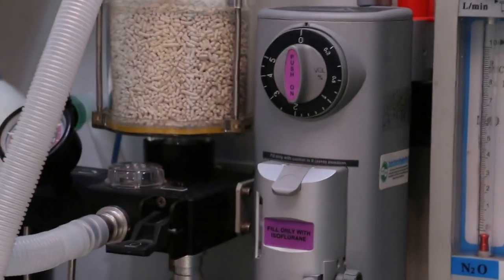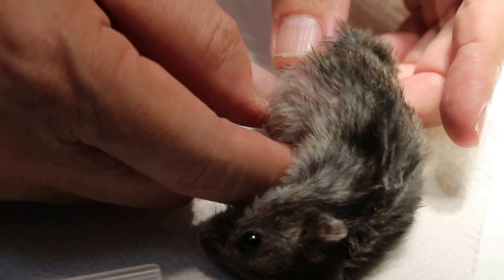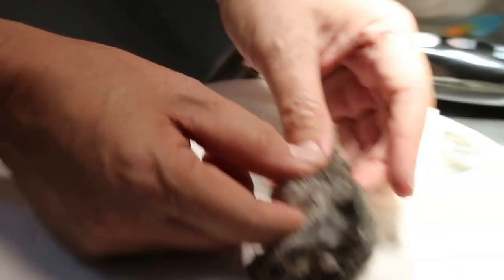And then we will shave that lump. This lump is here. Now you shave. I do preparation first. Actually, the lump is 2 lumps — or one inside here as well. I can't make the shape.